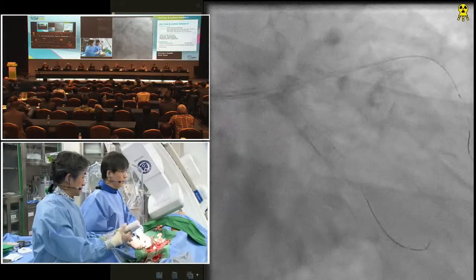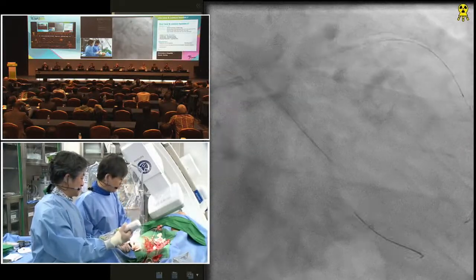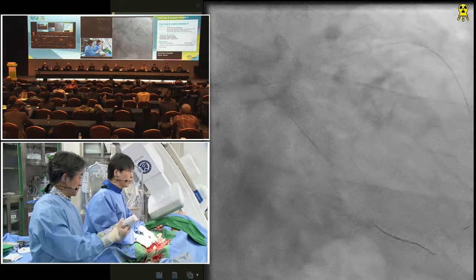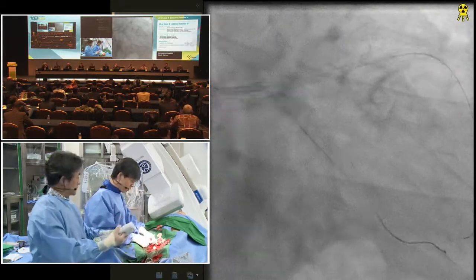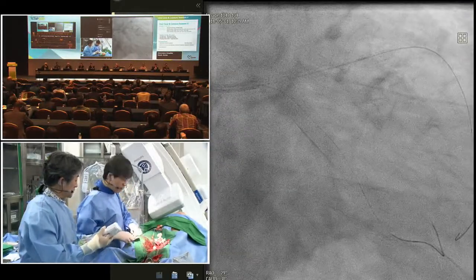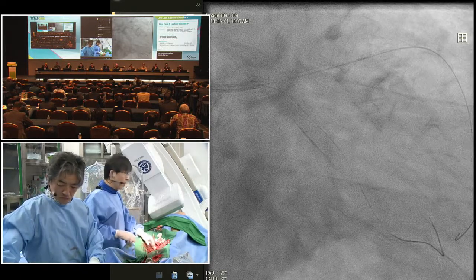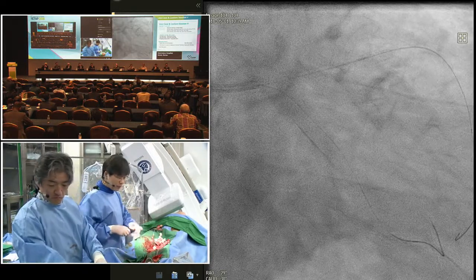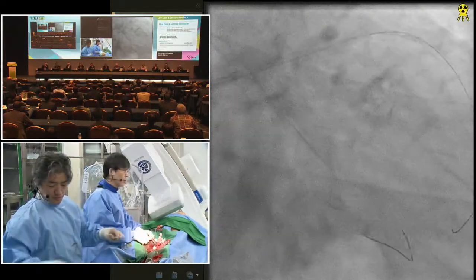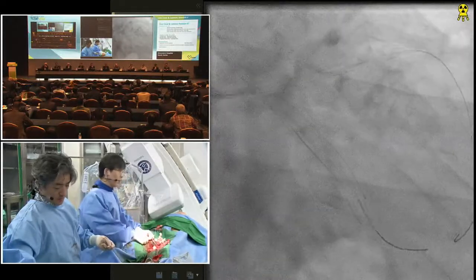The first point is what is the lumen cross-sectional area of the ostium of the circ. Second is the stent status at the distal left main, really fully apposed or not. Finally, whether the stent was covered or not in the left main ostium.